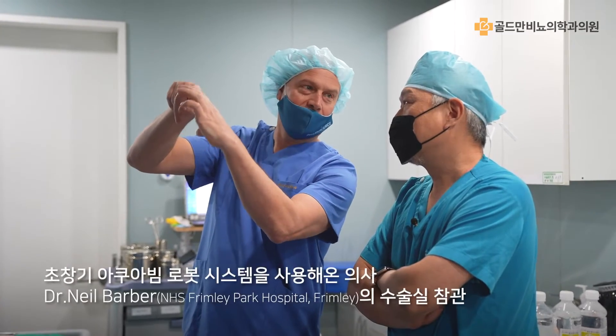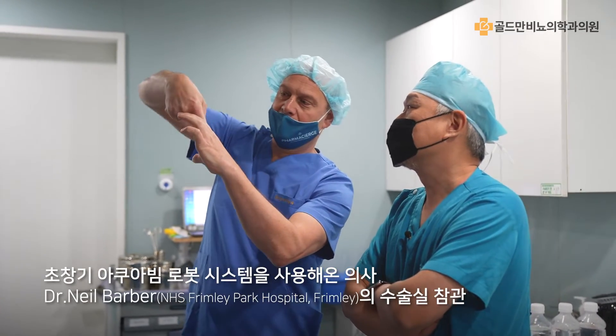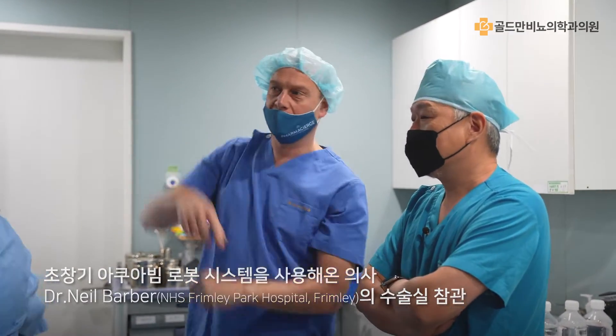The less pressure, the more anterior the device will sit, and you can sweep by and sit quite like that.